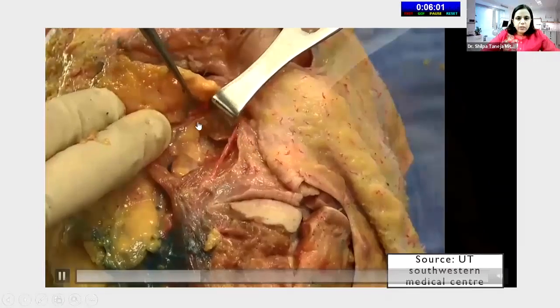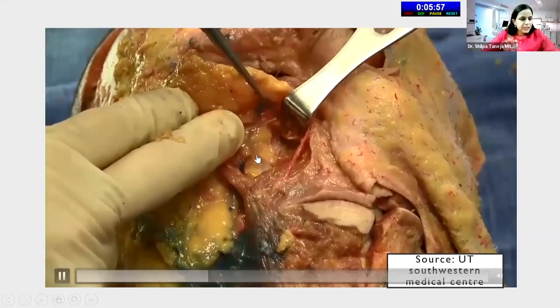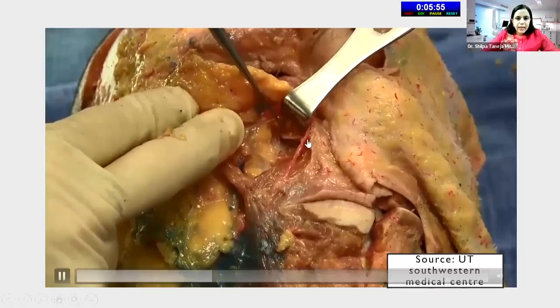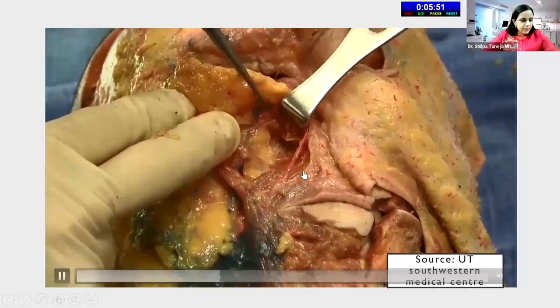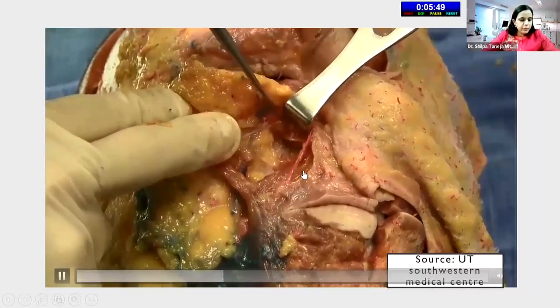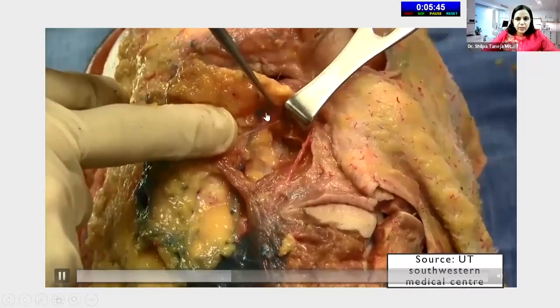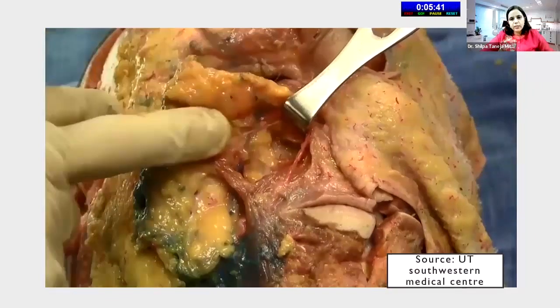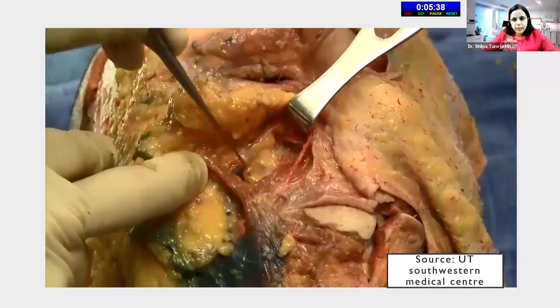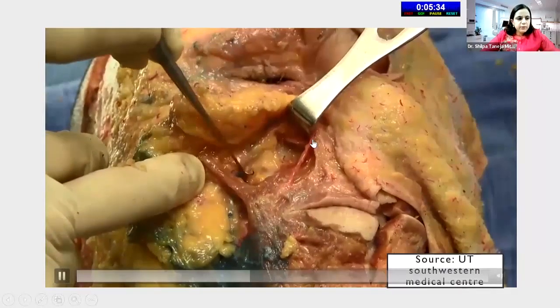Whenever we want to inject fillers in this area, the malar area, it is important as we inject to take care of these mimetic muscles and inject 1 finger breadth below the inferior orbital rim and inject laterally and not medially, so that we do not first of all accentuate the nasolabial fold, and also the inferior orbital nerves and vessels lie here.